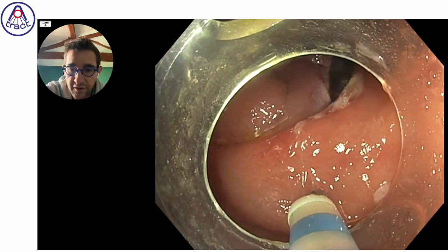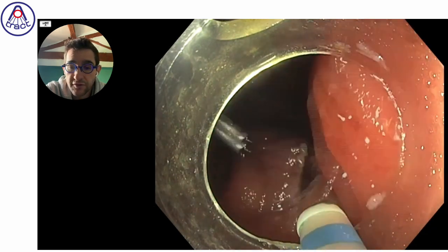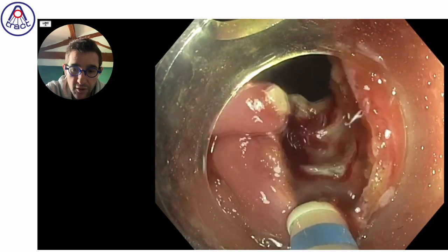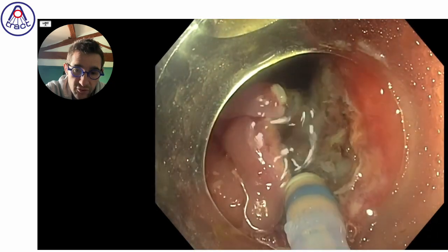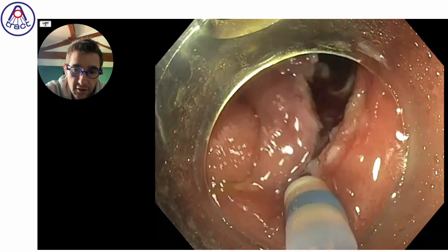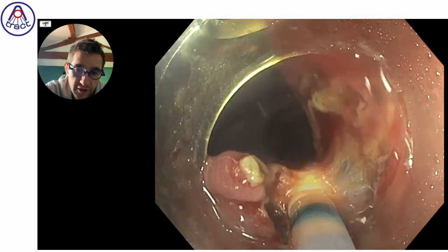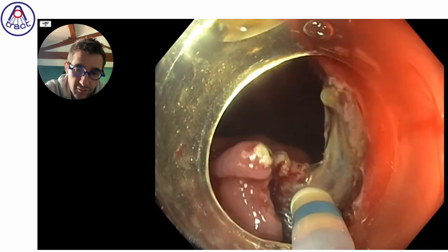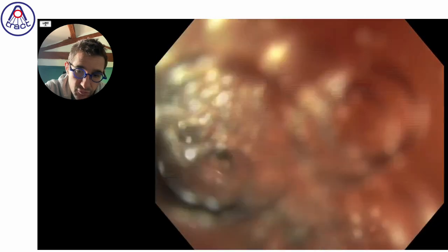low efficacy because if you don't see the vessel, it is very small, less than your knife. So getting the chance to coagulate without seeing exactly what you are doing is more chance than really technique. So the best way probably, in this case, is to open again. Therefore, you make the area not so blind.